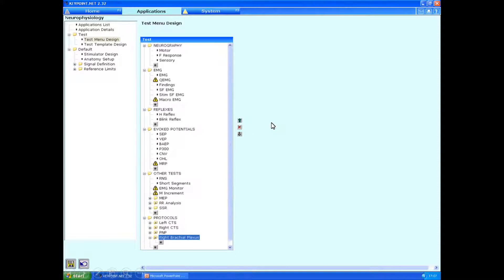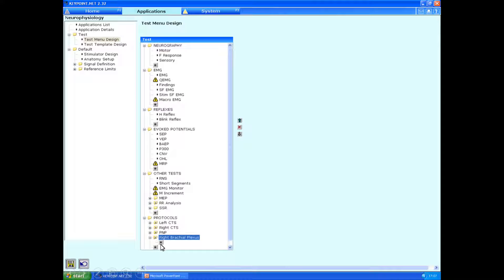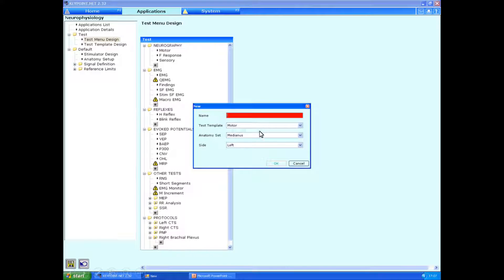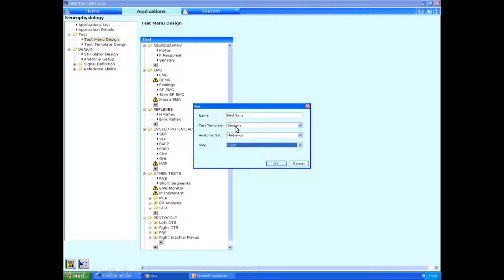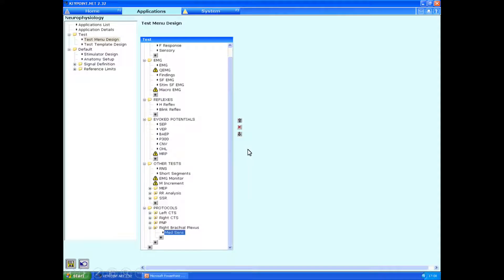And you can now see that this is now populated within the selection of protocols. Underneath it is a small little star which we can press. And it will bring us the option to start adding tests in. So under the name, which is what the test is going to appear as on your title bar in the main program, let's type in median sensory. We'll select from the test template the sensory nerve group from the median nerve set and make sure it's from the right hand side.